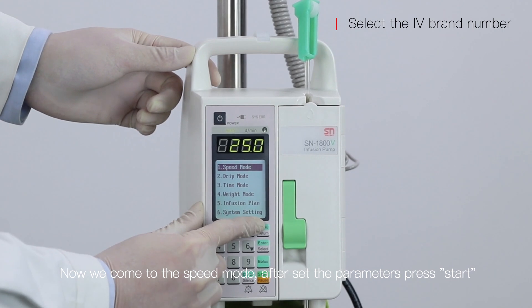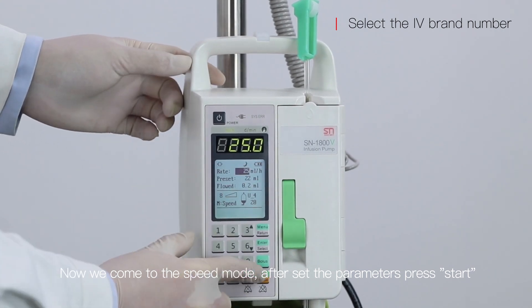Now we come to the speed mode. After setting the parameters, press start.